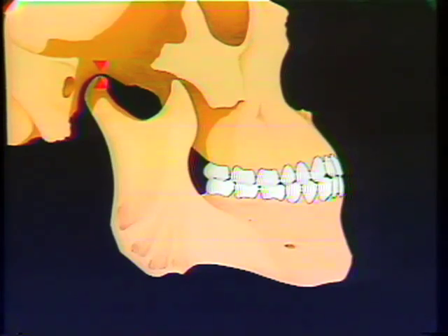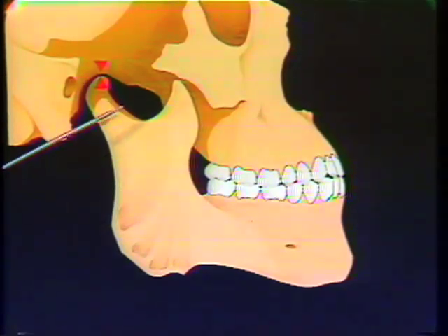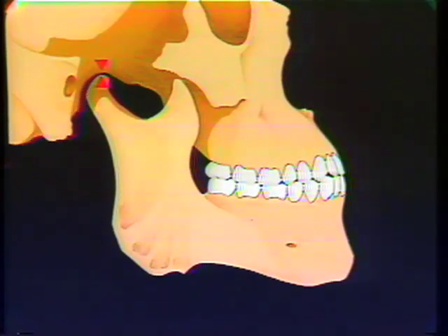Centric jaw relation, as we define it, is the position of the mandible to the maxilla characterized by a centered position of the condyle in its fossa — that is, the uppermost and midmost position — without compression or distraction of the surrounding structures. To determine centric relation as just defined, the intraoral gothic arch tracing has proven to be a reliable and relatively simple procedure. The apex of the gothic arch represents, under normal physiologic conditions, a reproducible border position of the mandible from which lateral movements can be made.